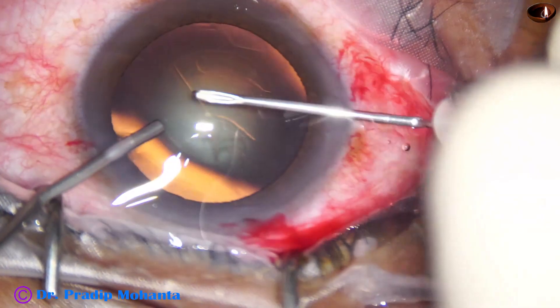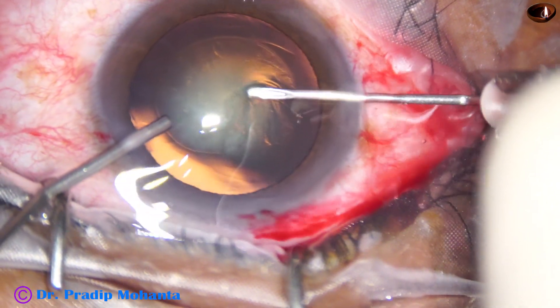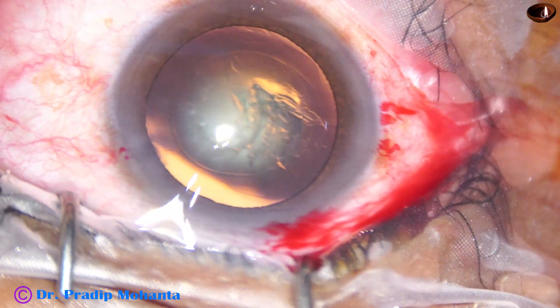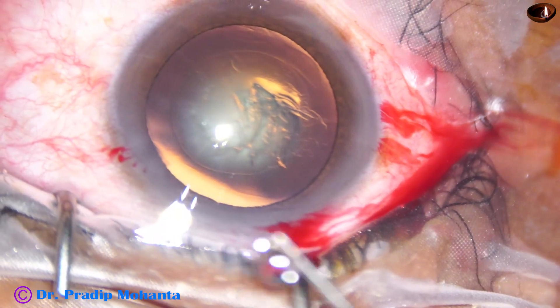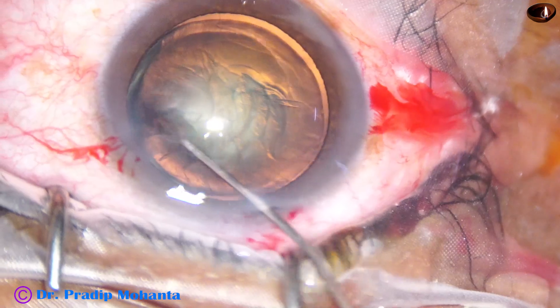Now, keeping the eyeball stable, he takes the cystitome and does the incisions through the right side port. Now hydrodelineation is done — see what happens.